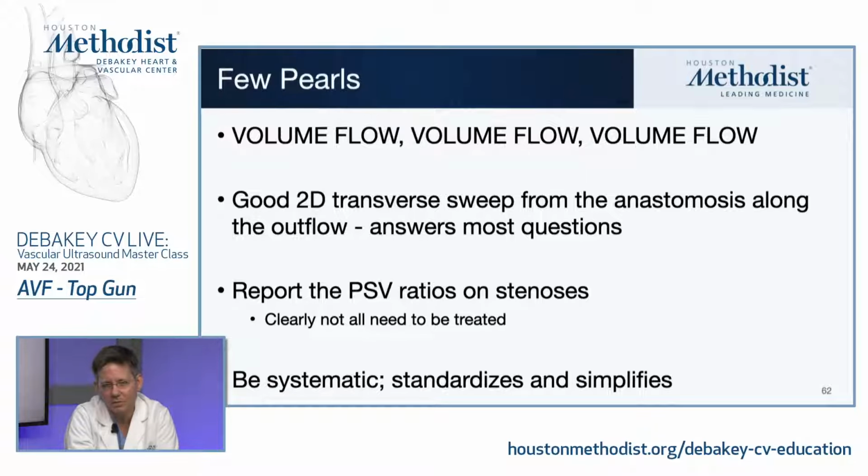You can see shriveled up segments of this vein where it's sclerotic. You can see the aneurysms. You can see that it's crazy tortuous. You can see areas that are too deep. A lot of those things you can really tell.